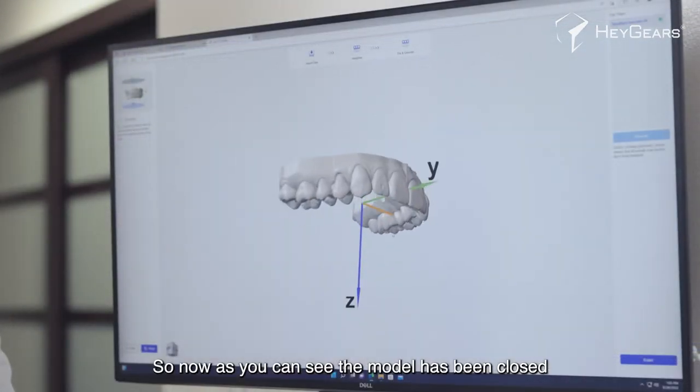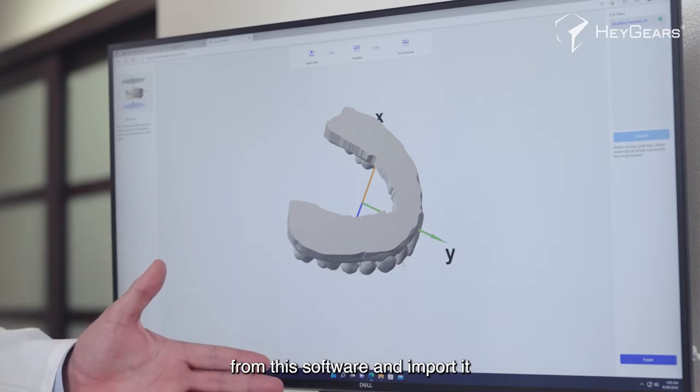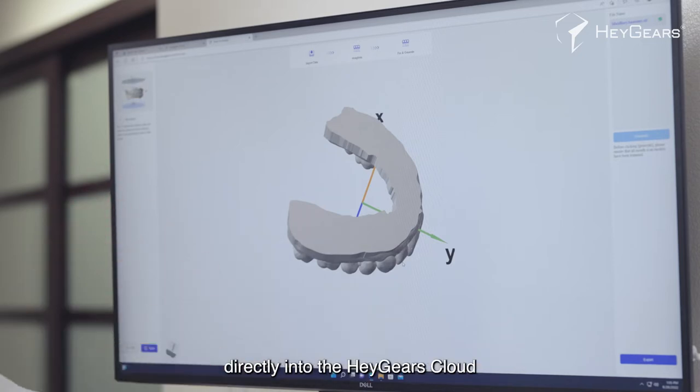As you can see, the model has been closed and completed — this is something that is actually printable. The next step is to export it from this software and import it directly into the HeyGears cloud.